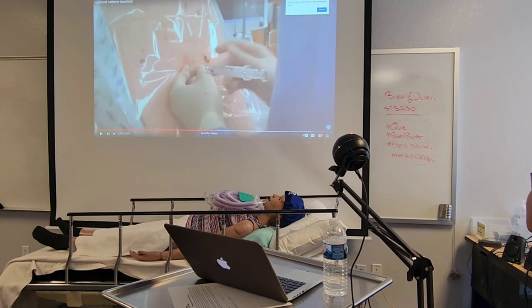Stupid question, why does it have to be glass? Because it's a low friction syringe. So if it's glass, then the syringe and the plunger inside are moving within itself very freely. If they used a regular syringe, we wouldn't have that feedback of the plunger going forward and knowing that we're in the epidural space.